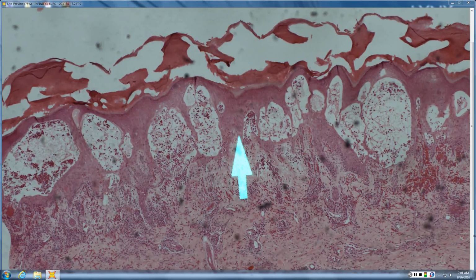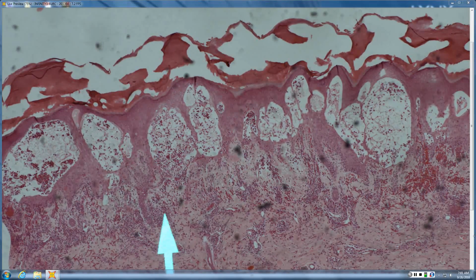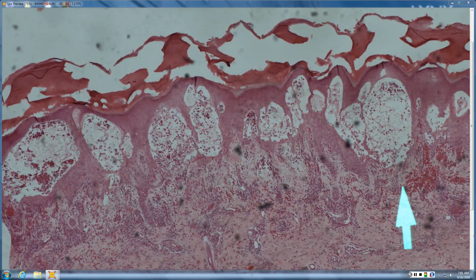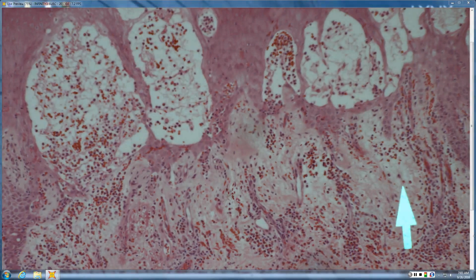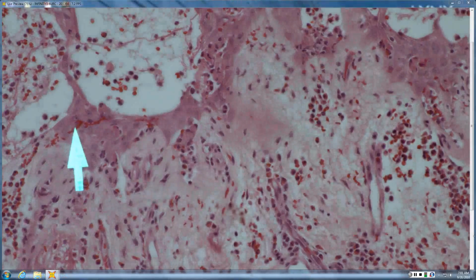That certainly puts you into the intraepidermal vesicle, spongiotic, acute spongiotic differential. And from scan, you see a lot of red stuff, which you think, is this erythrocytes, just red blood cells everywhere? Is it like a bloody process or something? And certainly there are erythrocytes in here. However, the majority of these red things are all eosinophils.